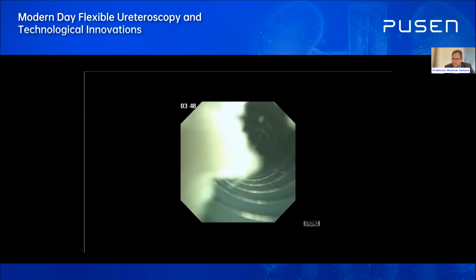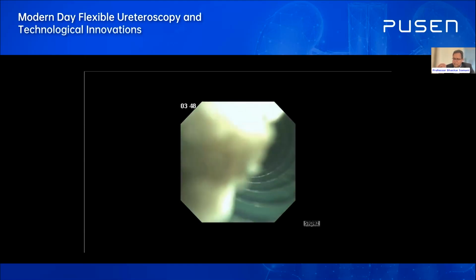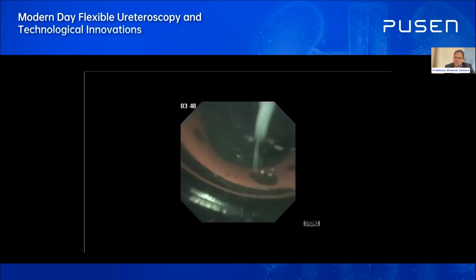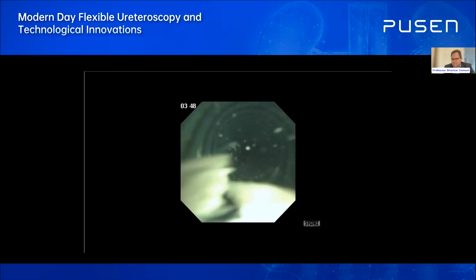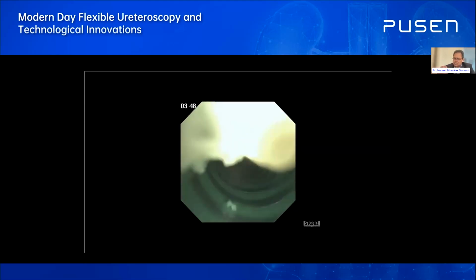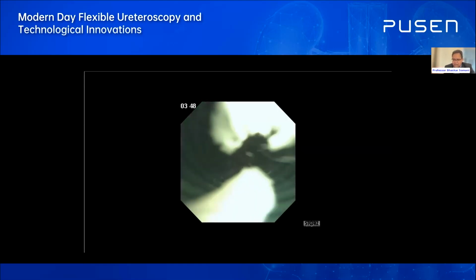And again, that is really good because especially with these matrixy type stones, where you have a lot of sludge, where you have a lot of debris, you can just drain it very, very easily. So for some of these, you come to the hilum and you can go back again and you keep doing it. I have to say, I'm still not fully optimized with what is ideal because it depends on patient to patient about what is the ideal suction, and hopefully we will get there.